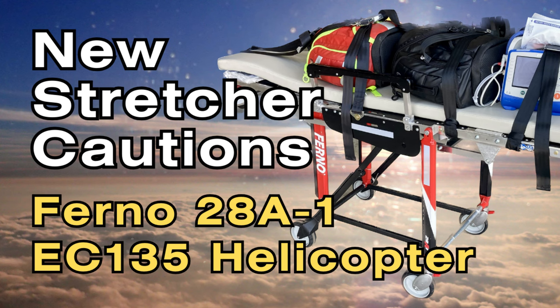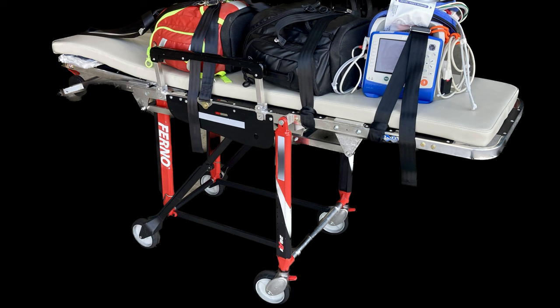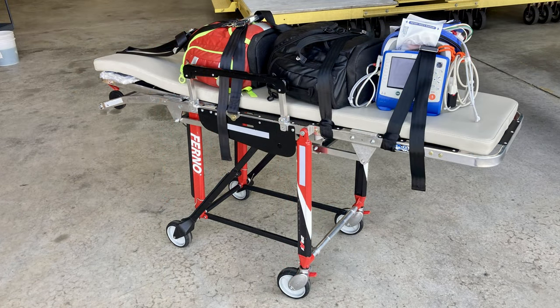Hey guys, welcome back to the channel. In this video we're going to go over the 28A1 Ferno stretcher or cot, and it's different than the 28A. We're going to go over the differences, review some information for the crew, and also review information that maintenance needs to know about. Since a lot of us are getting the new stretcher, there are some cautions people need to be aware of.